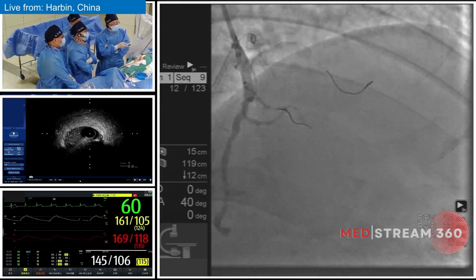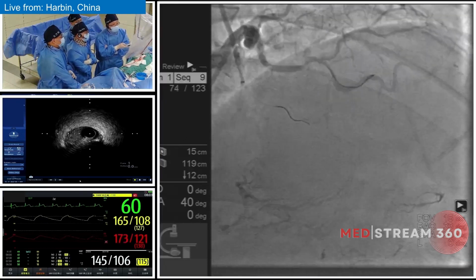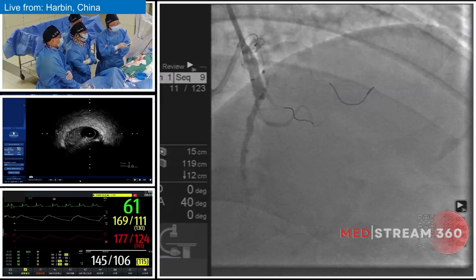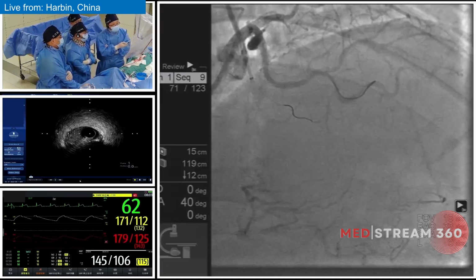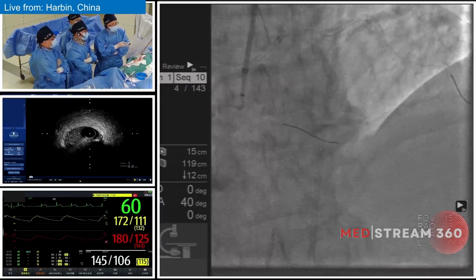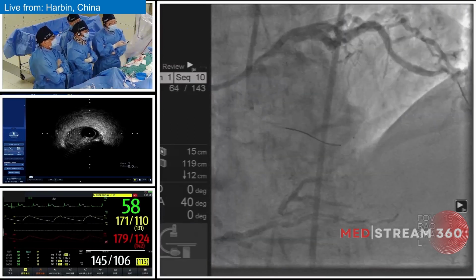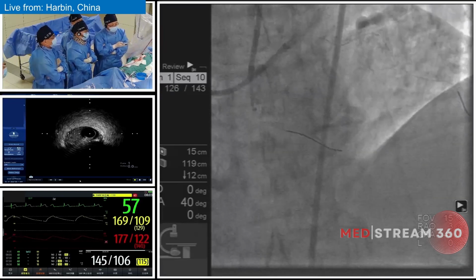This is the bilateral angiogram, RAO cranial. We can see the occluded segment and the LAD with calcification. In the middle portion of the LAD, just at the diagonal branch area, it is patent, but before the diagonal branch there is some plaque. Let's see the AP view. Certainly, we could sometimes try the retrograde approach, but we must check the RCA first.